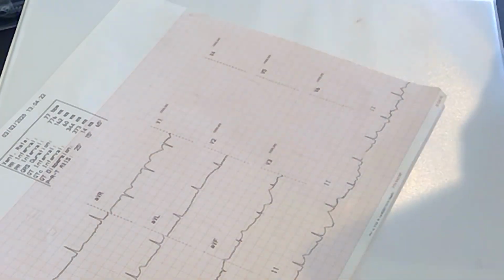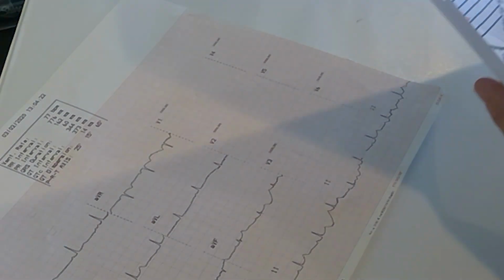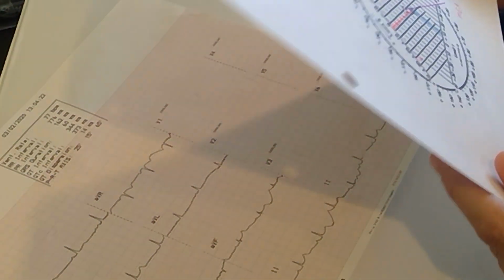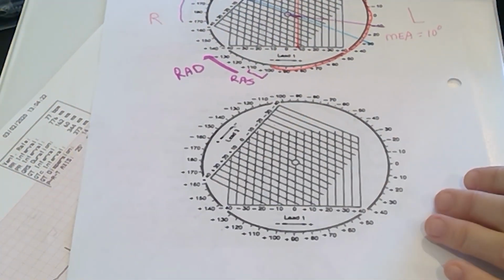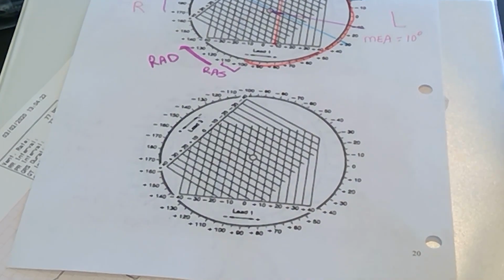Now, I'm going to demonstrate another phenomenon where we were trying to show you a movement of the MEA. Remember in lab, you held your breath.